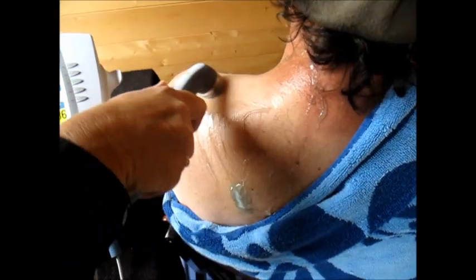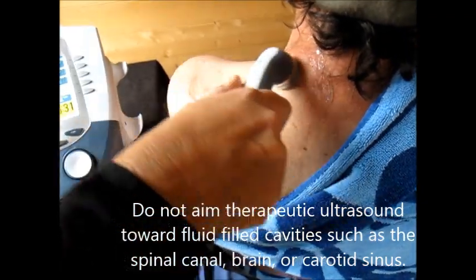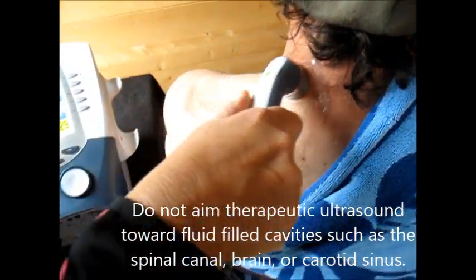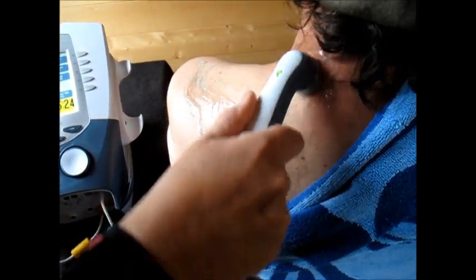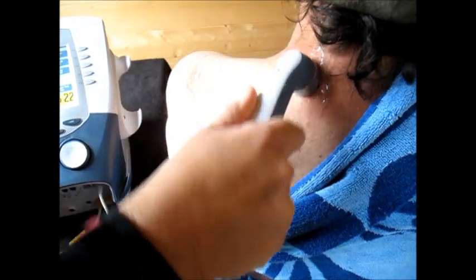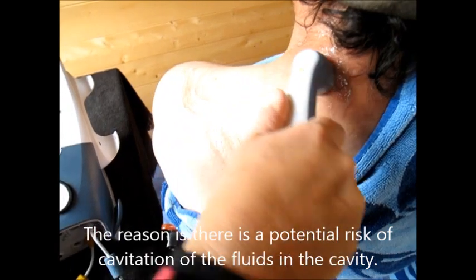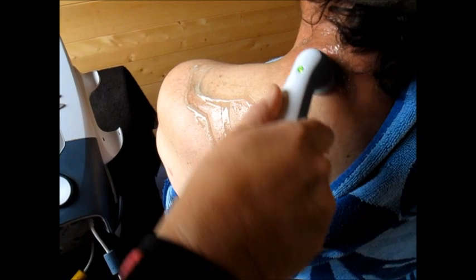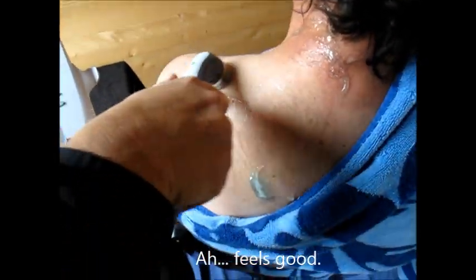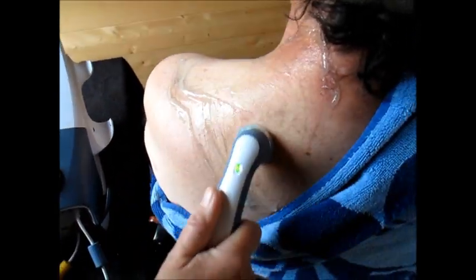The other thing about therapeutic ultrasound is you don't want to aim it towards any fluid-filled cavities in the human body — the spinal cord, the brain, the carotid sinus. There is a potential risk of a cavitation effect, which means a bubble could form in the liquid of the spinal fluid, and that would be terrible. So keep that in mind as an important contraindication. Feels good, doesn't it — we'll get rid of some of these trigger points in here.